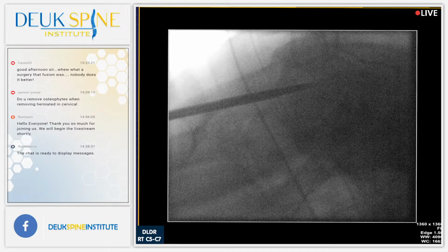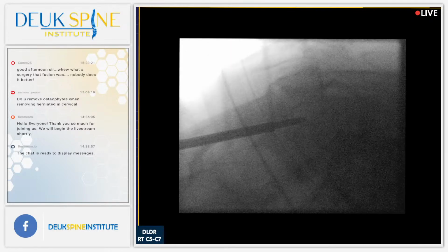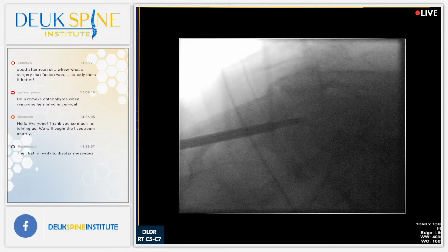What do we got? Let's have some irrigation. Maybe there's a little bit of dye. That helped. Yeah, that's the problem. I'm right at the mid vertebral body end plate, and I'm struggling to get it pointing up, you know?